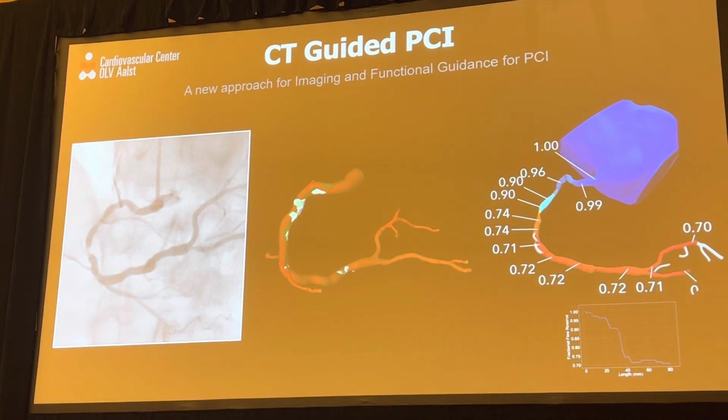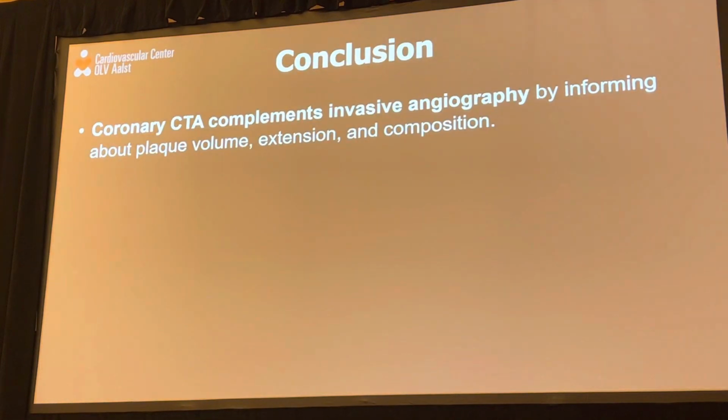At the end of the day, this is what we have. So this is the information that we combined for the trial. Of course we have the conventional angiography. In addition to that, we have the 3D plaque morphology, and of course we also have physiology.